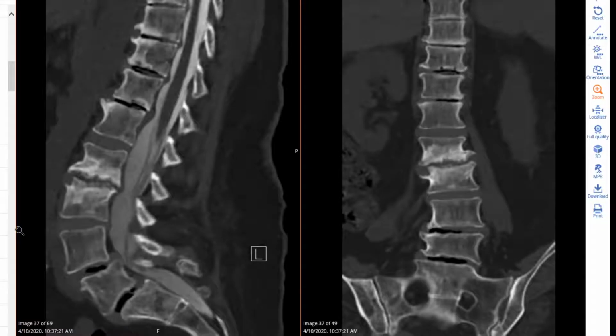Today I decided actually to explain these pictures and the patient and the case instead of putting music on. So this is a 65-year-old female with a long history of back pain and radiculopathy. Most of the symptoms though correspond to the lower lumbar spine, L2 to S1. And as you see, we are dealing with grade 2 spondylolisthesis, quite significant disc disease, and scoliosis.